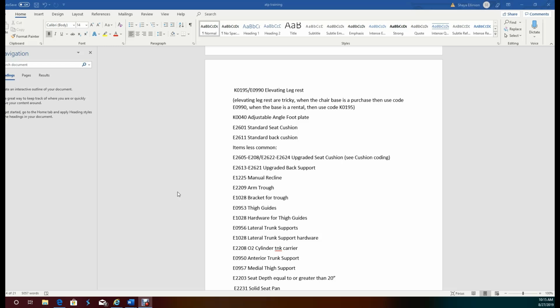When you give the patient a wheelchair, you want to make sure that their toes and heels are flat on the footrest. And if the patient has drop foot or plantar flexed, you want to bend the foot plates slightly downward. This will accommodate the patient's range of motion in their ankle and give them full surface support from heel to toe.